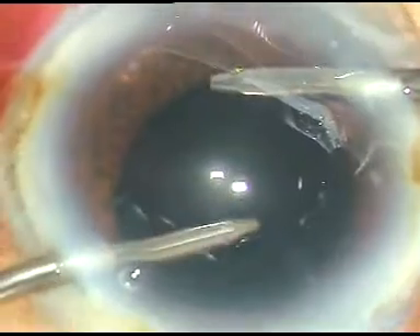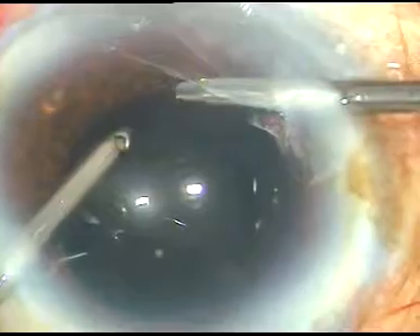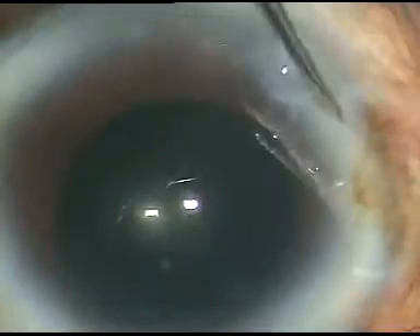Now I use bi-manual irrigation to clean out the viscoelastic substance finally. The side port incisions are nicely hydrated with BSS.